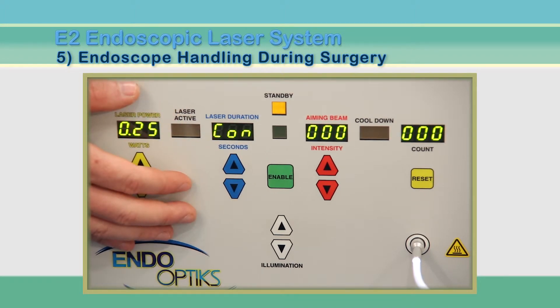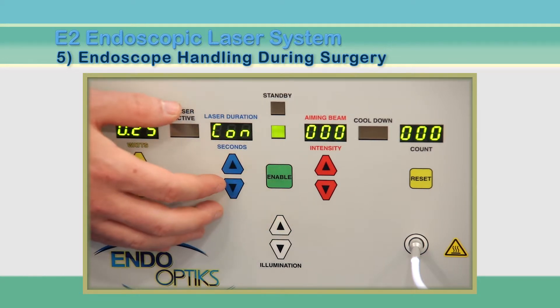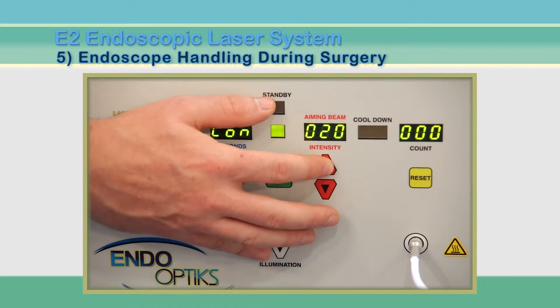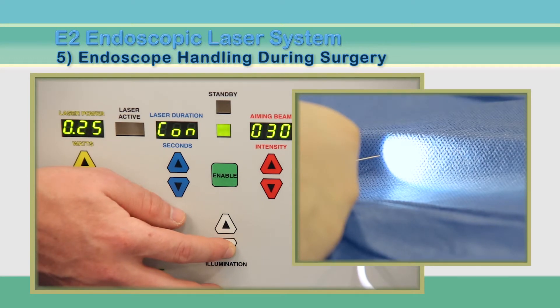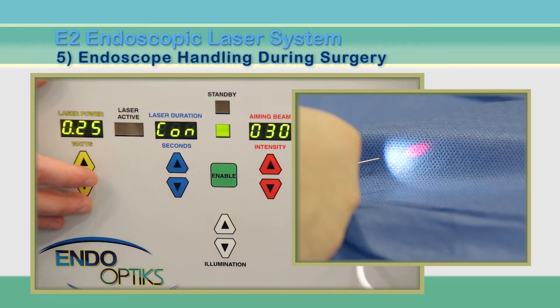When the surgeon is ready for the endoscope, press the green enable button to activate the laser. Then press the up arrow for the laser aiming beam two or three times to get the 20 or 30 setting. When the white light is reduced, the laser aiming beam should be clearly visible on the screen as a small red dot or donut, and you will see the red glow from the tip of the cannula.